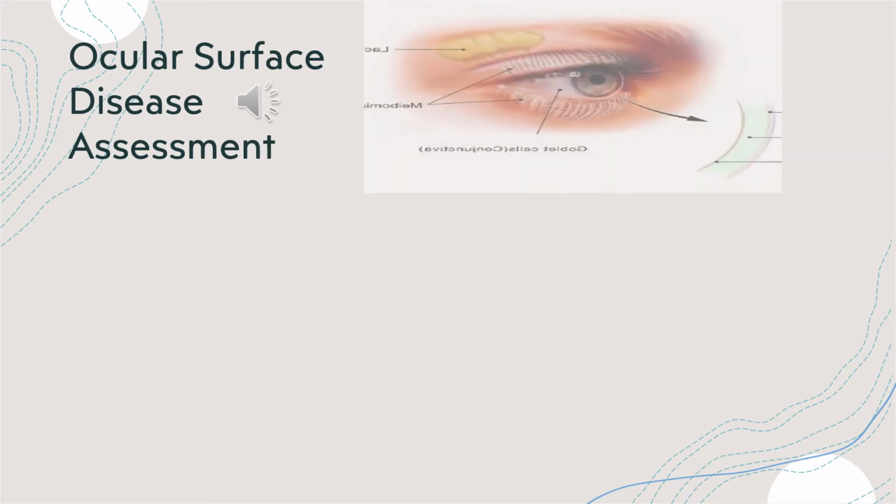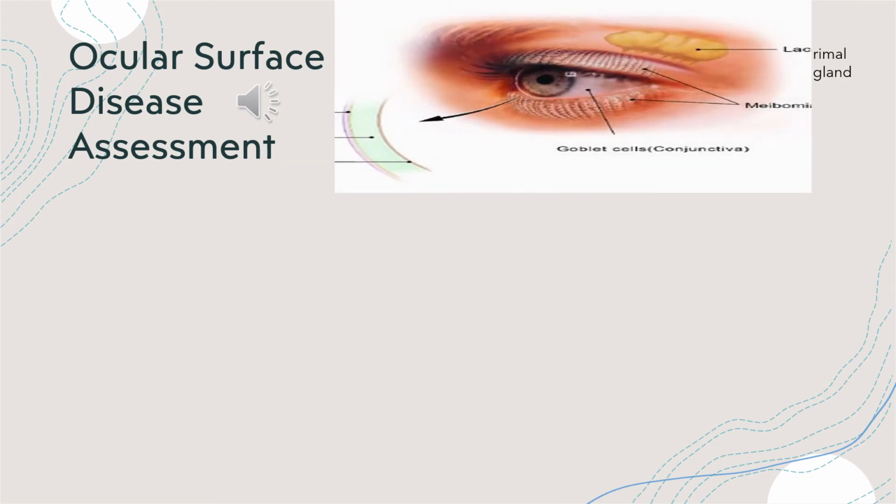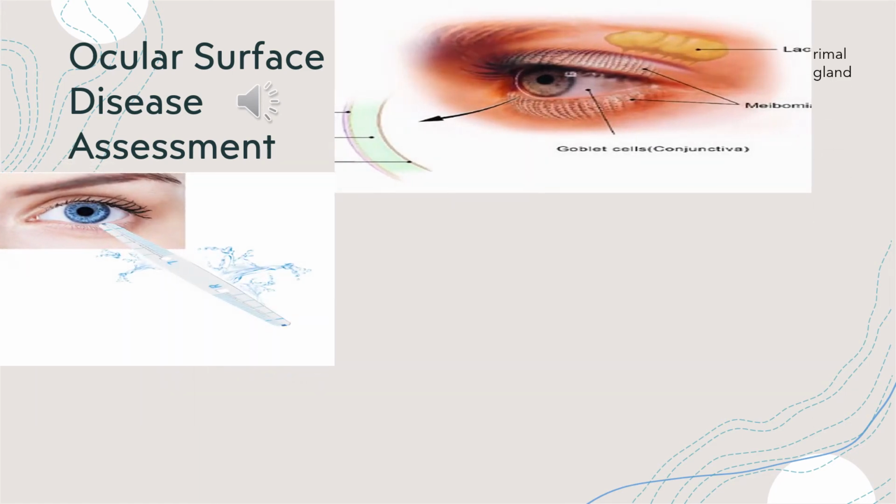Next is checking your lacrimal gland. How much water are you producing? Instead of the old painful Schirmer's test, we use a new pain-free SM tube test that measures the eye tear volume in 5 seconds. Readings under 5 are abnormal and 5 or above is normal.